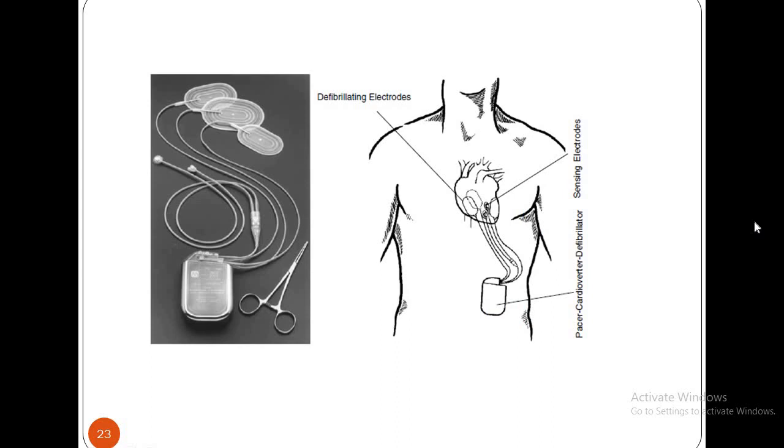The figure shows the pacer cardioverter defibrillator.